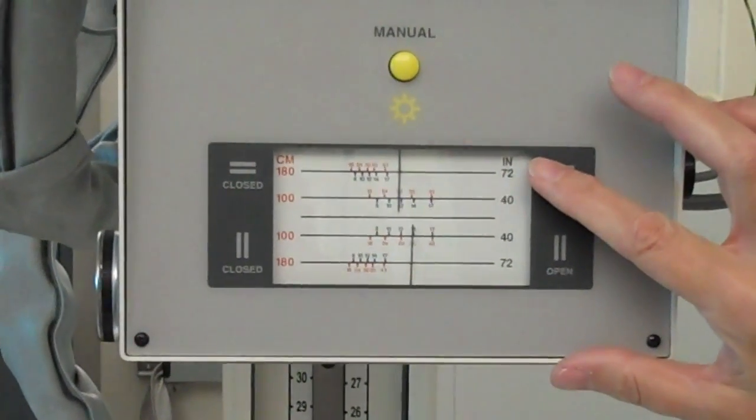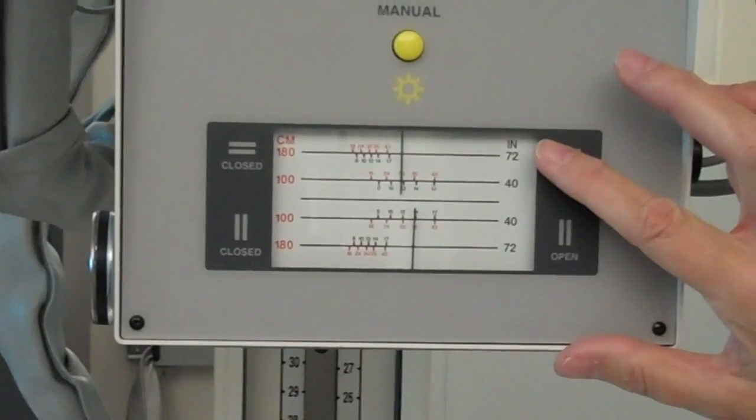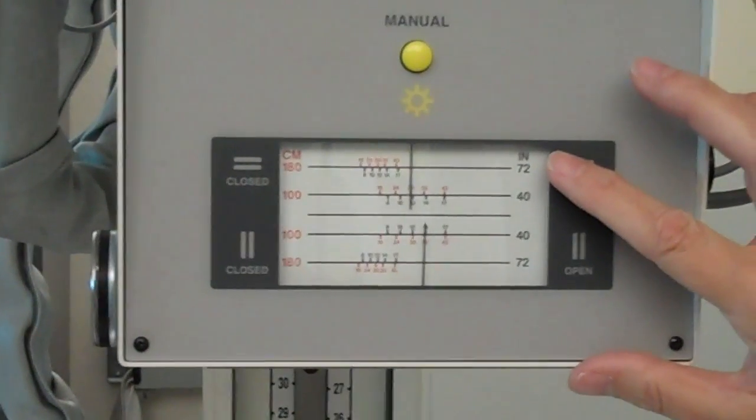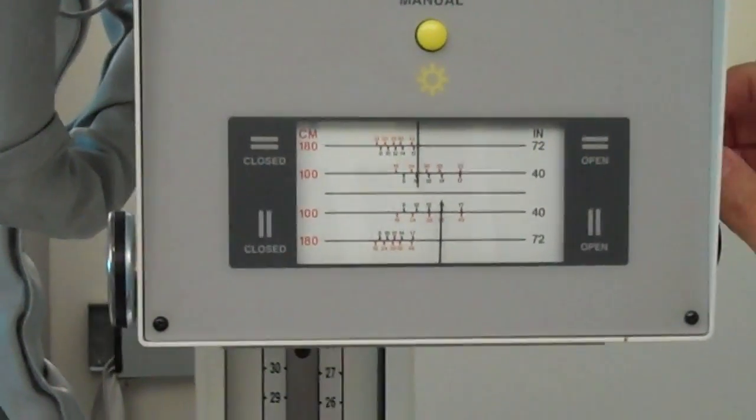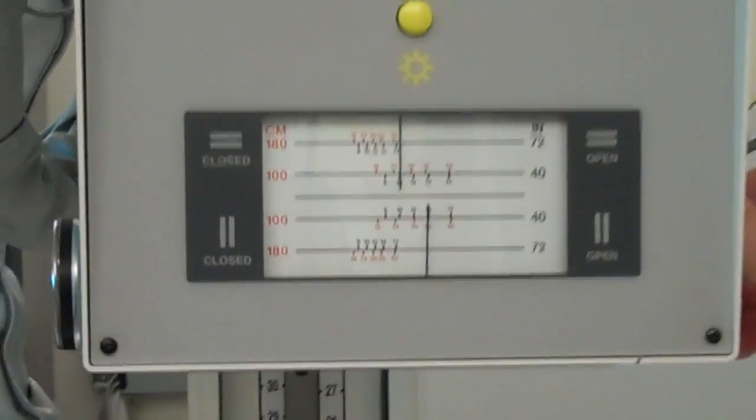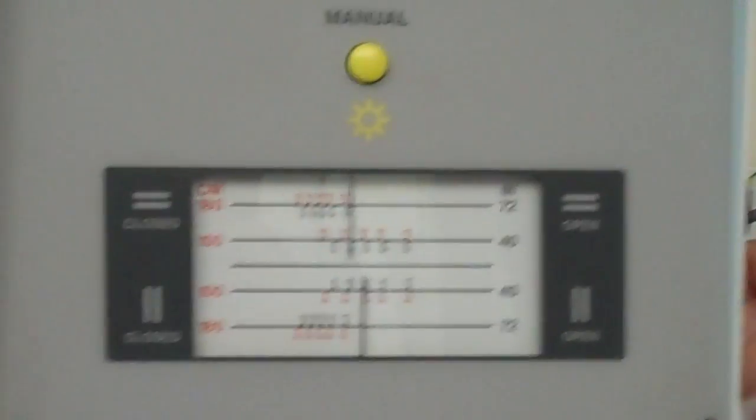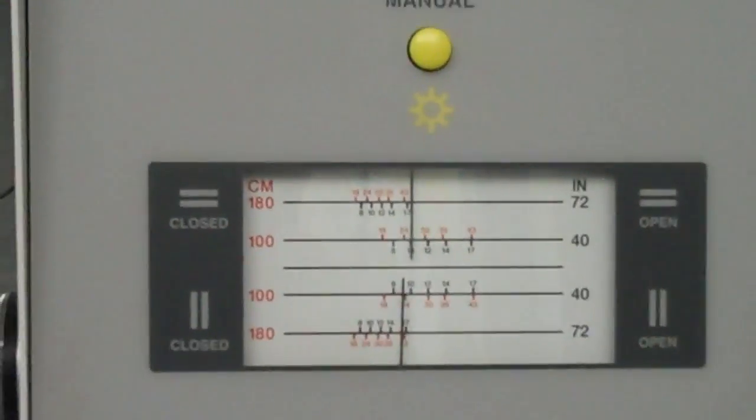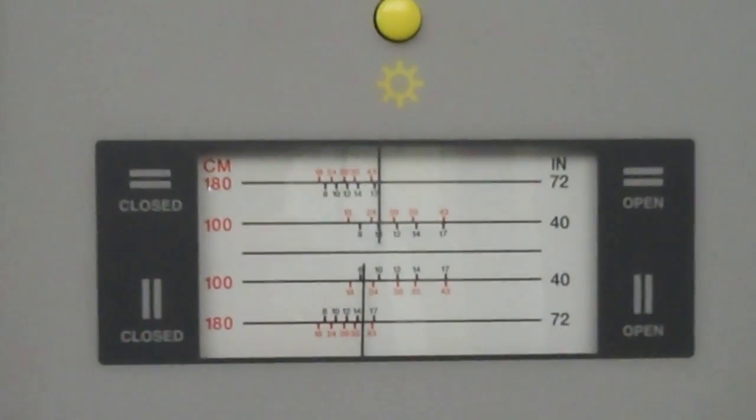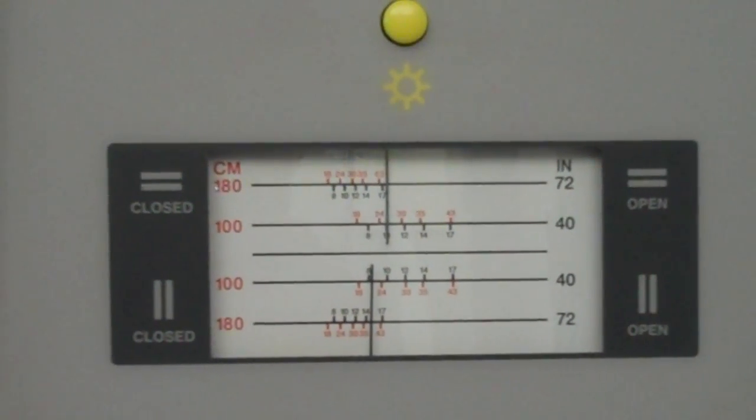We have a small image receptor, an eight by 10. So we are going to select eight by 10 at 40 inches.